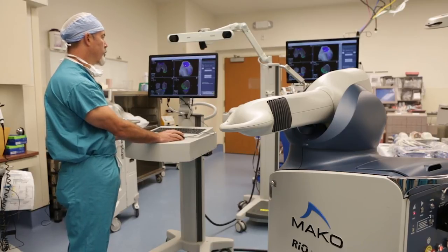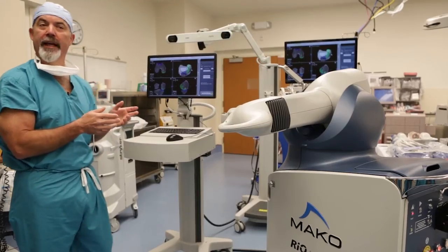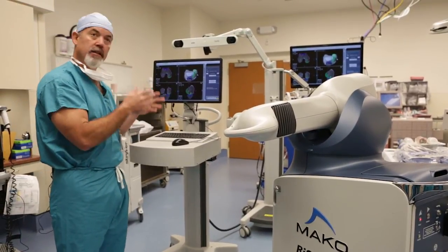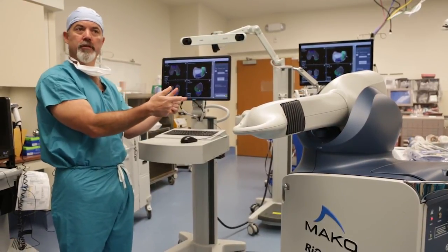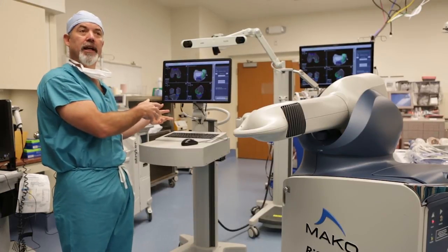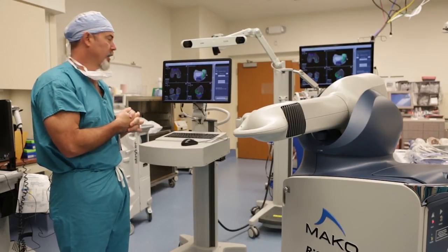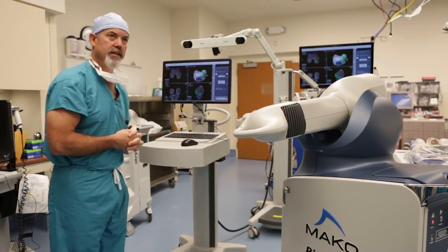I now have my preoperative plan done. We haven't touched the patient yet — all this information has been gleaned from CT scans and creation of a three-dimensional model. Intraoperatively, which you'll see in a short time, we have the ability to modify this and change any of these pieces to achieve optimal ligament balance. Thanks, that's it.